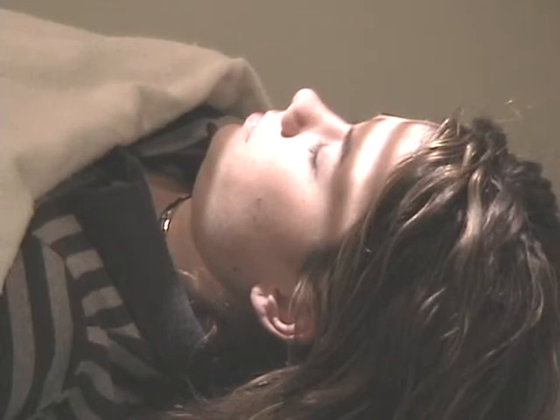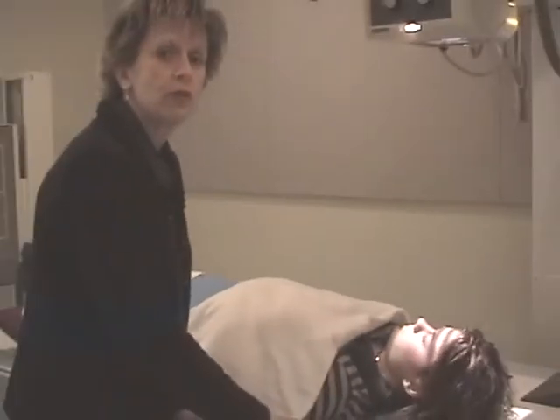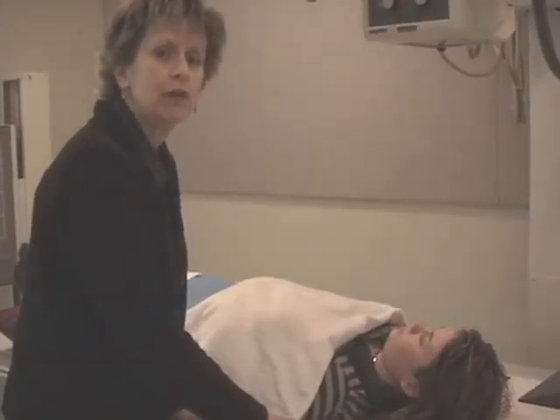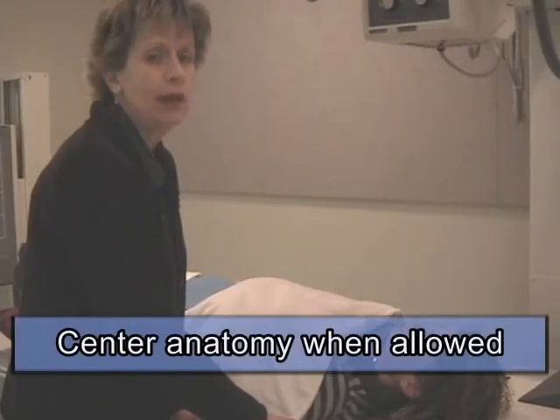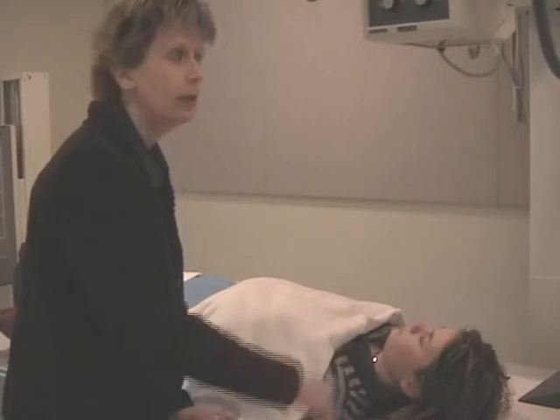Now, if you cannot palpate the skull, because of pain, bleeding, or fracture sites, those are reasons that you would not actually find the landmarks yourself. Using the film's edge 2 inches above the vertex is a perfect solution. The skull may not be perfectly centered, but you'll have good clearance and you will not clip pertinent anatomy. Center your anatomy when you can do so. If not, use these reference points that we're telling you.